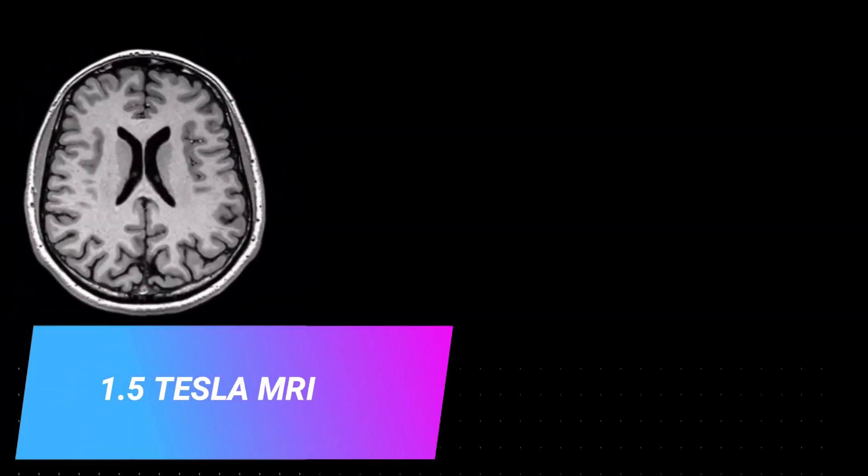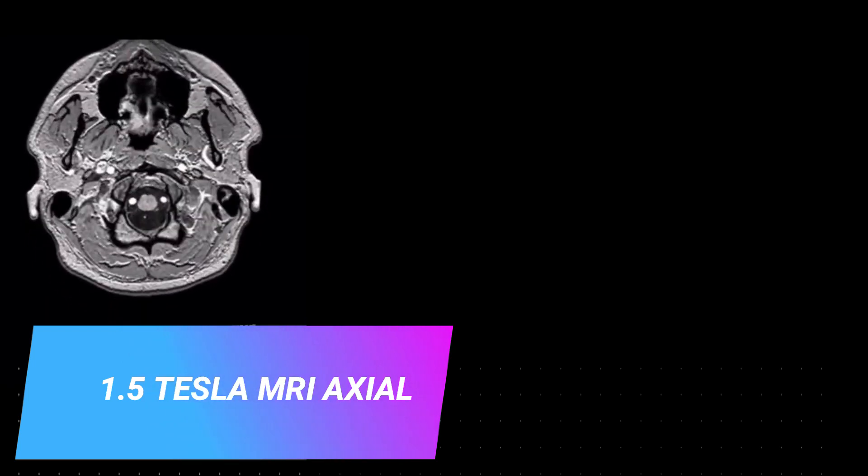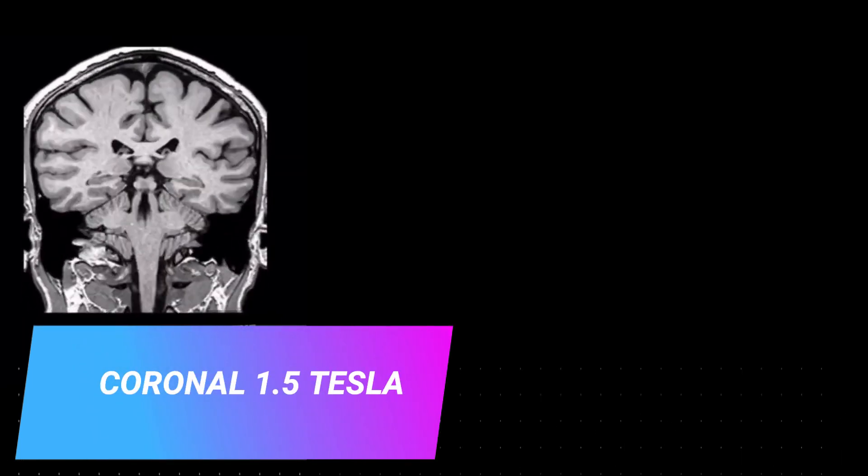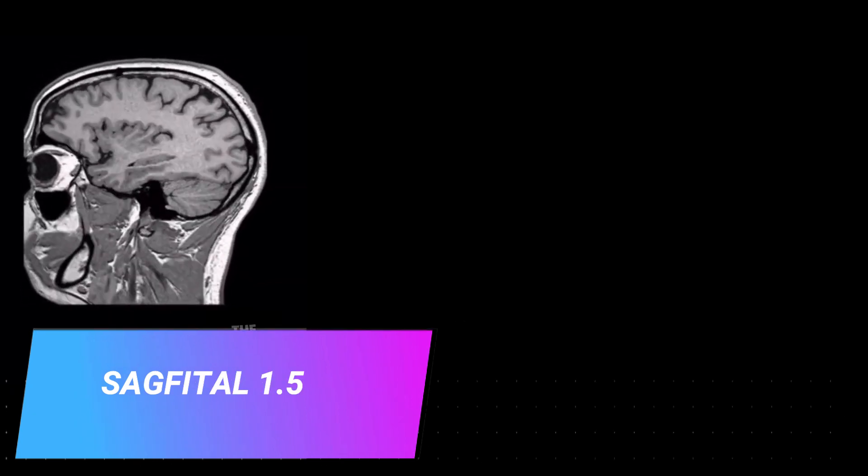It's a 1.5 Tesla MRI axial cut. This is the quality of 1.5, I'm just making you simply understand. This is coronal, now finishing the coronal 1.5 Tesla cut. Now let's go for the next one - sagittal. As we know there are three basic planes. Now if we go for sagittal, this is 1.5 Tesla. Now let me show you the clarity of the seven Tesla.